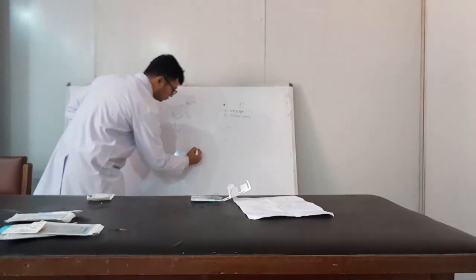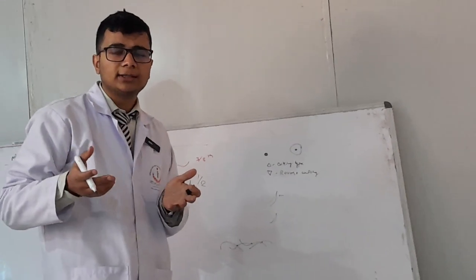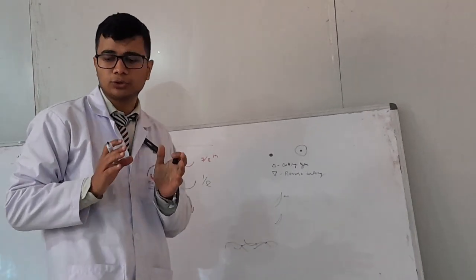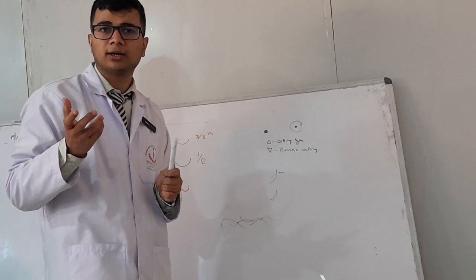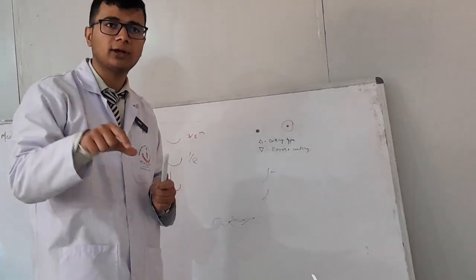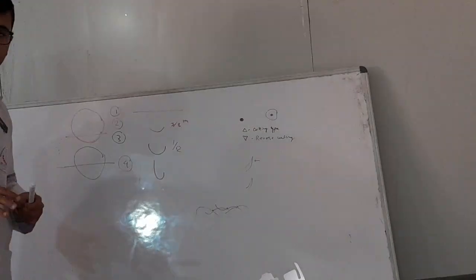Another important thing to keep in mind is that multifilament sutures are interwoven in nature, so they go like this, isn't it? While going in this pattern, you see here there are different gaps and spaces in it, and in those spaces bacteria like to grow. So suppose your tissue plane is such that you suspect it may get infected, or previously there was a wound, then it's better not to use multifilament sutures. It's better to use monofilament sutures. Keep this in mind, because monofilament sutures are smooth, so bacteria will probably not like to grow and sit in smooth places. Rather, they prefer rough surfaces, with ups and downs and different corners. So these basic fundamentals we need to keep in mind.